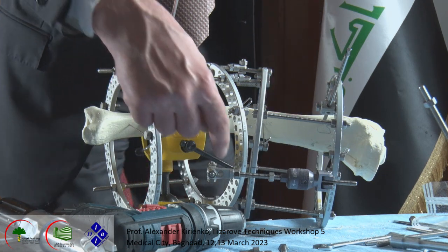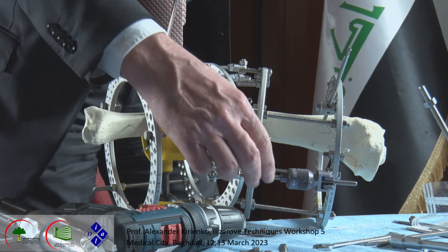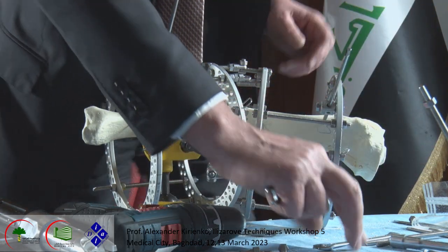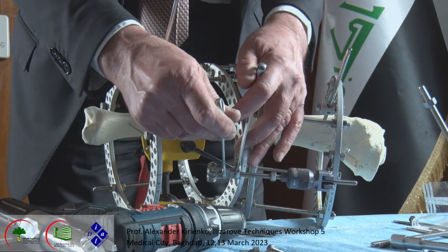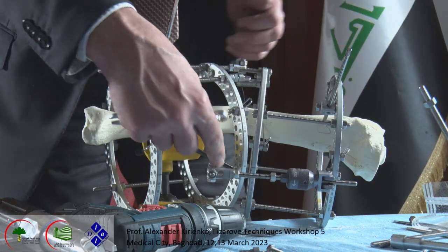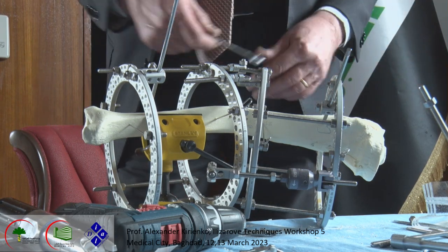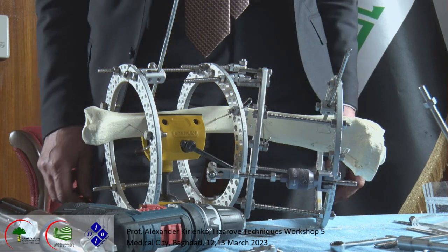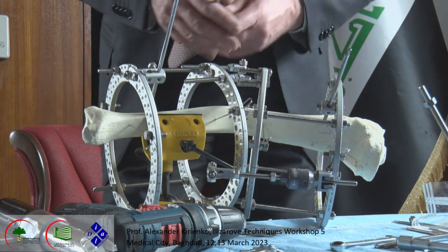For this reason, the much more comfortable, much more powerful system is this motor here. It is not so comfortable for the patient because it's bulky, but it's comfortable for turning the nuts, and much more important, this motor will function better than all other systems here. Okay, but now what I show you, I should show you how it functions. We remove the plate.